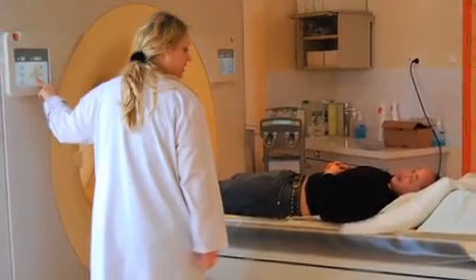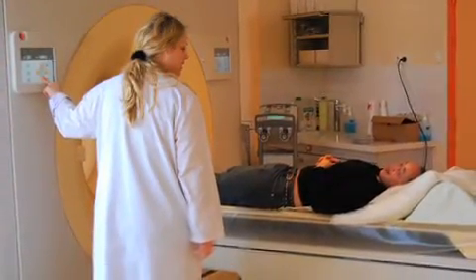And as we now go to cardiac imaging, we are able to get consistent high image quality, and are able to do non-invasive assessment of the coronary anatomy and, of course, pathology as well. And we can also look at a lot of the other morphological features in the heart, but, of course, everywhere else in the body as well. I think that the main advantage of the new generation of CT is, apart from the more stable and really very good image quality, the fact that we're now able to do that with a substantially reduced radiation dose.